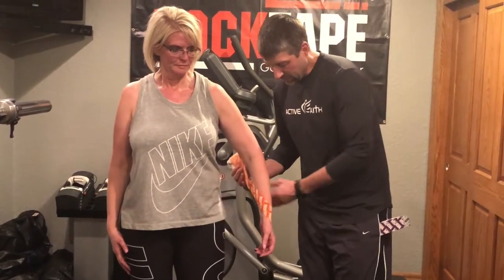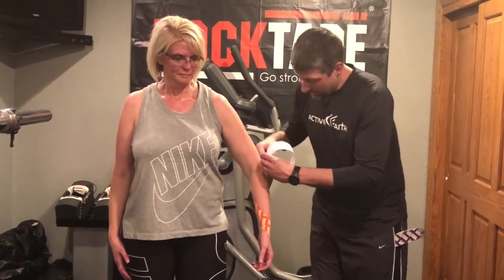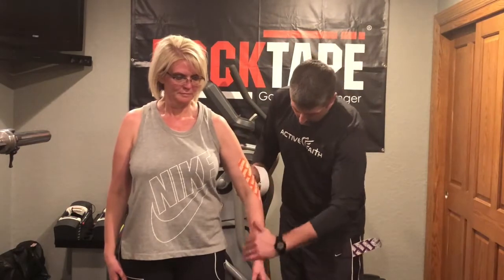I'm going to wrap this around in the helical pattern and end up here on the upper arm. Then I'm going to take another piece and go the opposite direction with it.